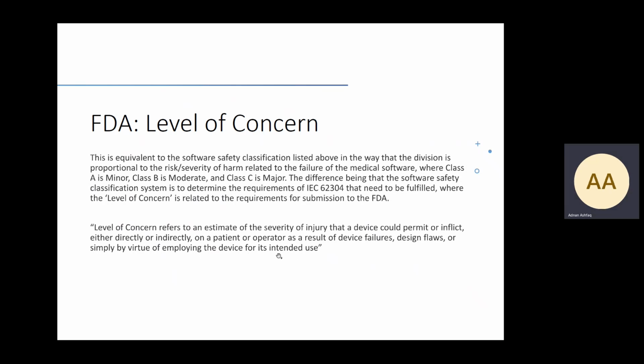And again, I must also emphasize the importance of beginning with a robust intended use, one that will identify clinical claims, the intended users, the intended environment of where the operating environment would be, all of these things. And in fact, if you want to know a good source for writing an intended use statement, you should look at the definition of intended use in ISO 14971, which outlines the different elements of intended use, and that will give you a much more detailed statement.